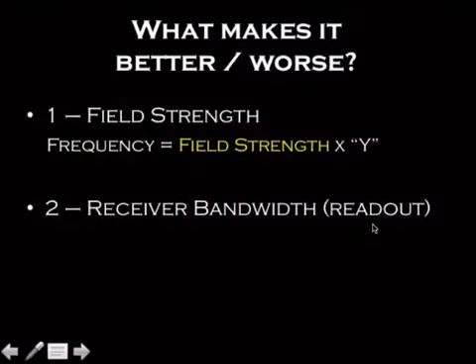All right, so this is another way that MR physics, they love to ask questions about what makes it better, what makes it worse. If we remember our formula, remember we had differences in frequency, and that equaled field strength times a constant. More field strength, or a more powerful magnet, a 3 Tesla relative to a 1.5, is going to make those differences more noticeable. In other words, a higher field strength makes the artifact worse.